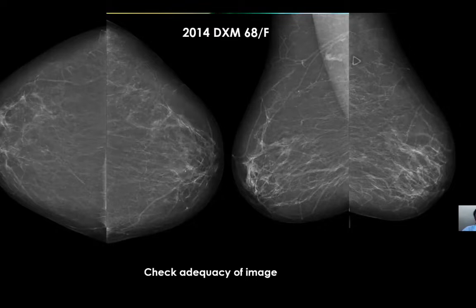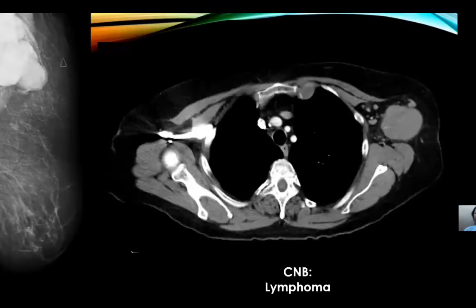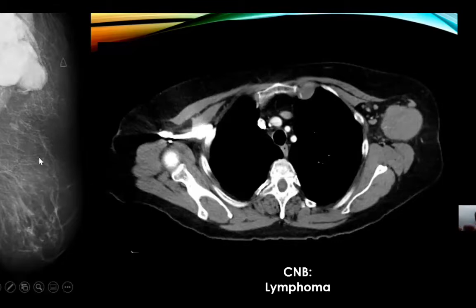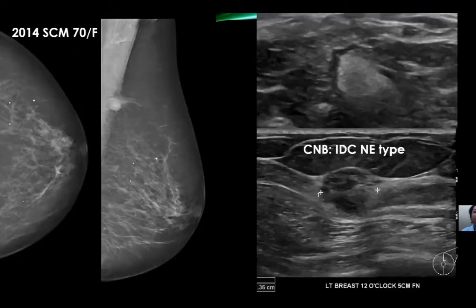If you don't take a good image, you're going to miss cancers. In this case, the pectoralis major was not included in the image, and therefore a mass as big as a golf ball could not be picked up. There was a big mass in the left axilla — and that was a lymphoma, not a primary breast malignancy.